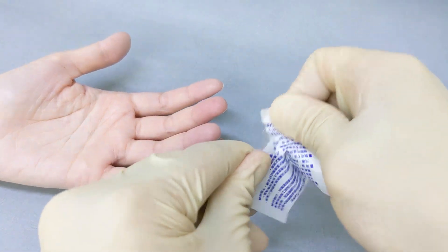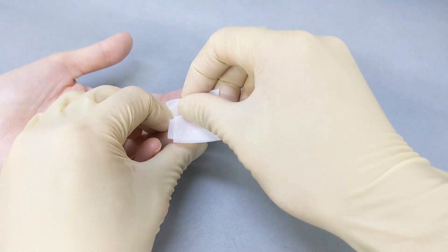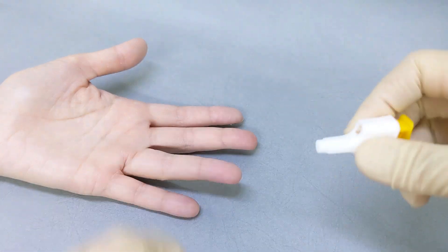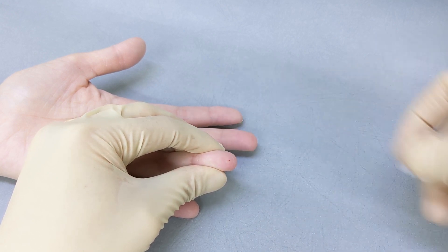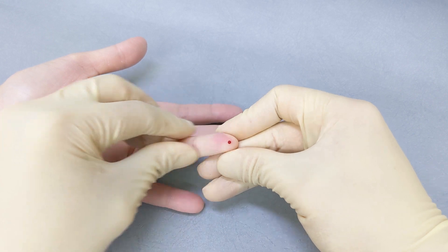Disinfect the fingertip where blood is to be collected and make sure the fingertip is dry before collecting blood with the lancet. Jab at the fingertip with the lancet and squeeze a small amount of blood. Gently squeeze towards the end of the finger to take enough blood sample.